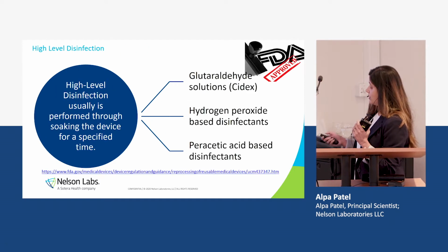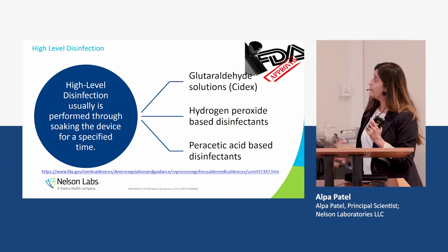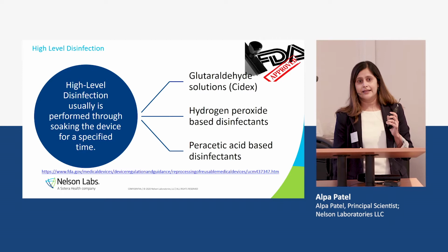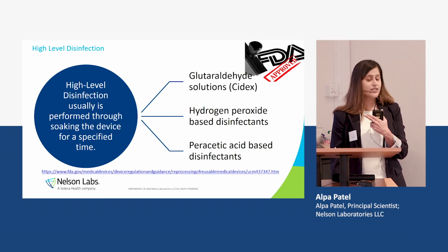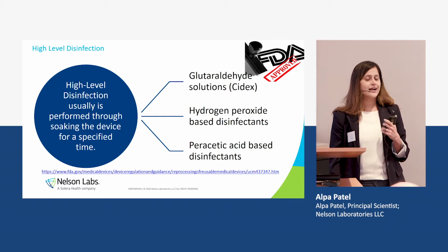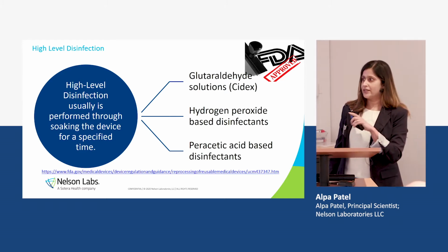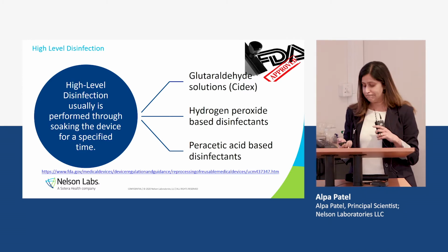Oh, let me just go over. You will see that there is not a huge selection. However, glutaraldehyde solutions is a dominant disinfectant that we use in the US. However, in Europe, a lot of the countries have banned the use of glutaraldehyde solutions or do not favor them. So we do see hydrogen peroxide and peracetic acid, or hydrogen peroxide and peracetic acid together, validated for the EU. So we do have 2 different disinfectants sometimes validated.